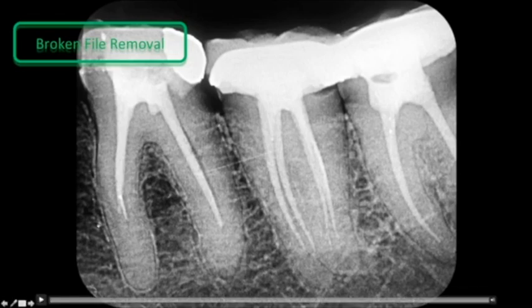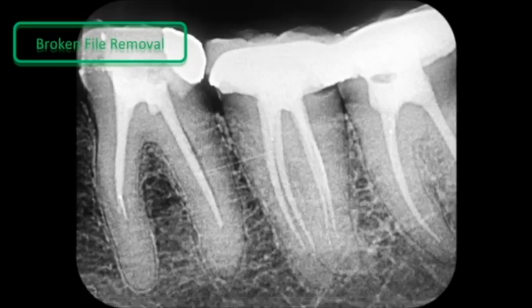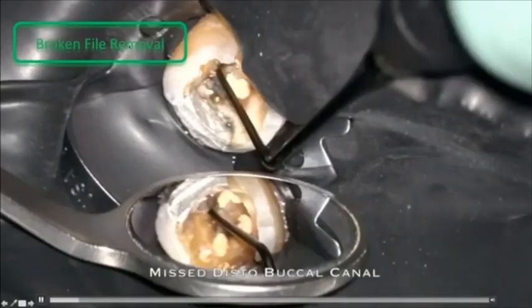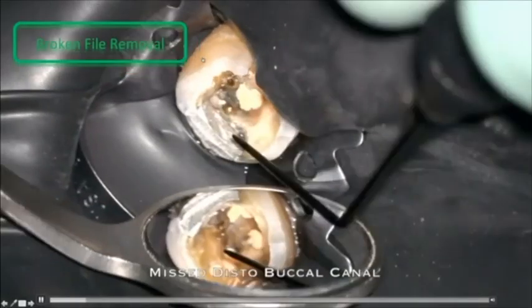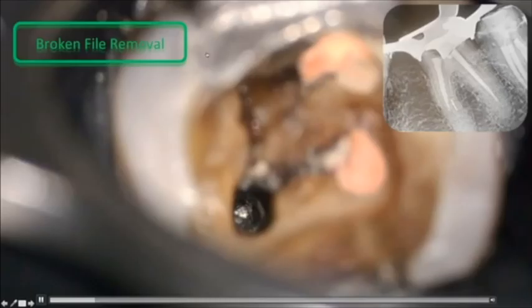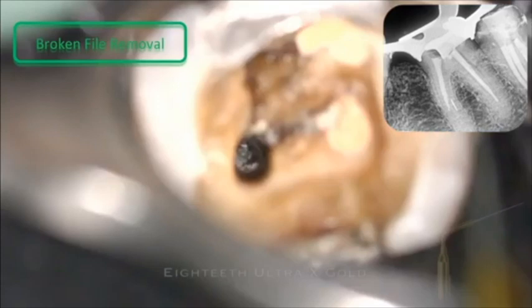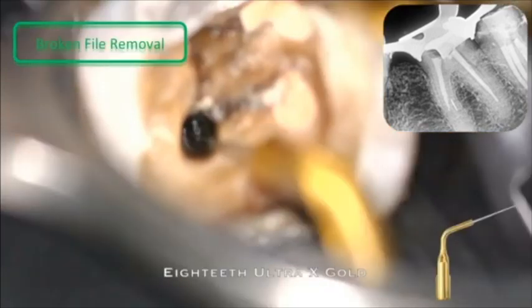So here we have a broken file in the first molar, and we can see a radiolucency on the distal side. So this is a complex case of retreatment. We have the first molar with a missed canal. This is a missed distobuccal canal and a broken file. So more complex. Here you can see that this file is in the mesial root and it's very big. It's accessible.